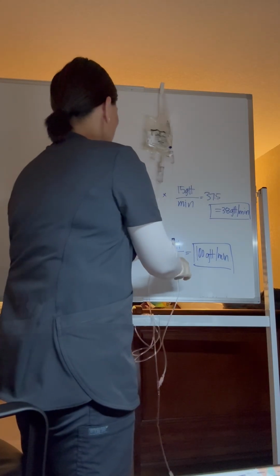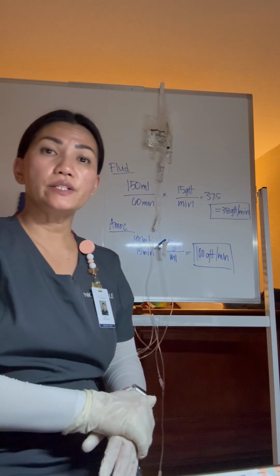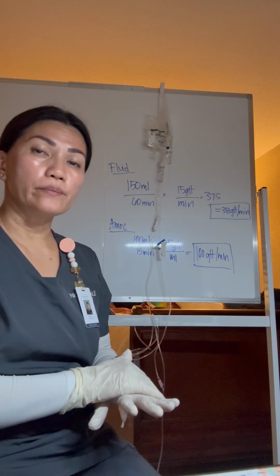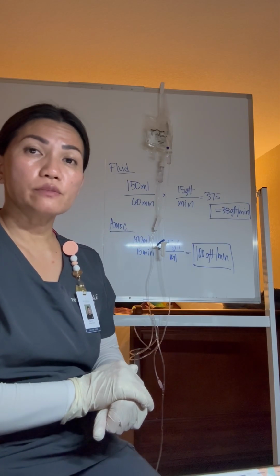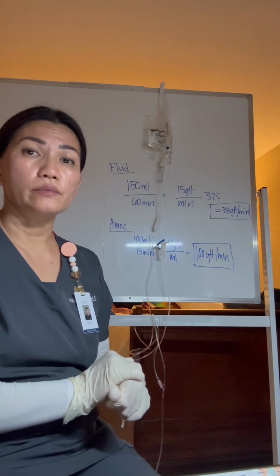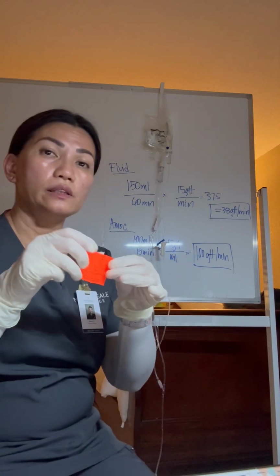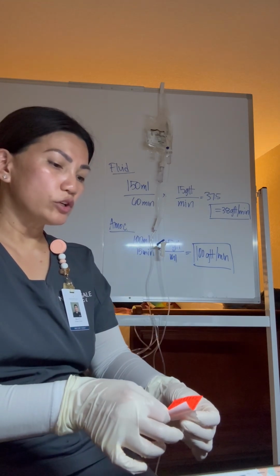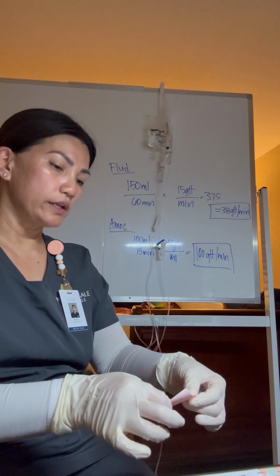Okay, so now that's all set. It's hooked up to our patient's IV line. You want to make sure that everything is going okay. We should have checked the IV site first to make sure there was no redness, phlebitis, no swelling or none of that before we hooked up our line. But I also have a label here, which I'm going to put on our bag. It has the patient's name, the drug, the amount, the rate, the time we started, as well as the flow, okay?